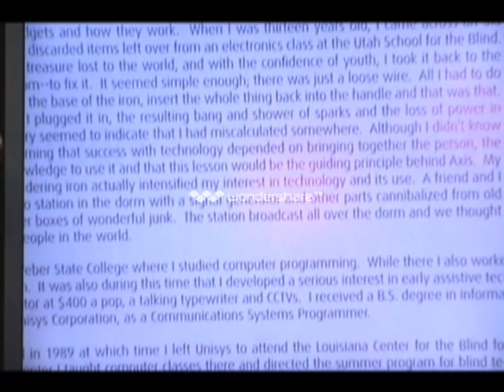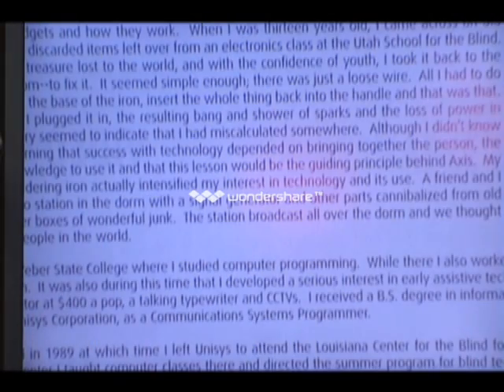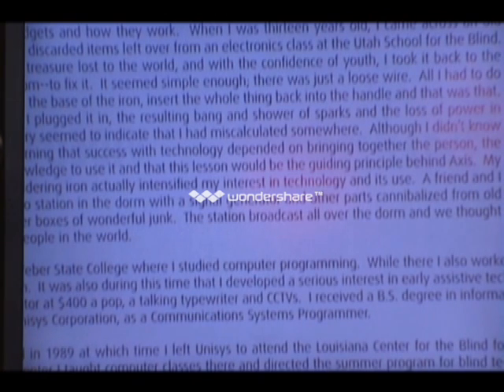Or if you're trying to read something in a newspaper and you're not sure where you are, you can put that locator dot right at the beginning of the article, then you can see where you're starting. That can be very handy because it can get a little disorienting at times when you have the image fairly large. And I tell people that writing on one of these things is kind of like the way we used to score bowling in the old days. You wrote on the page or on the plastic, and it showed up on the screen up on the wall. Okay, I'm thinking it's 3:35 already.